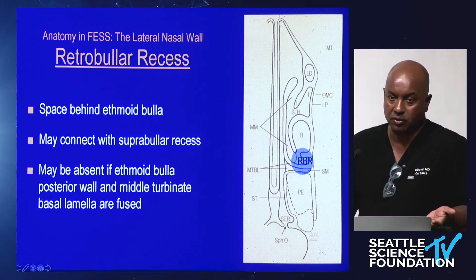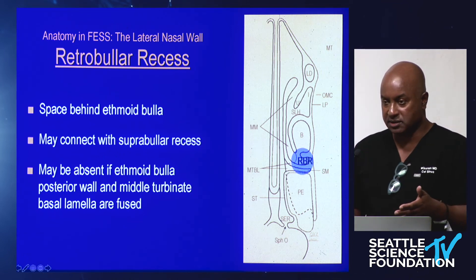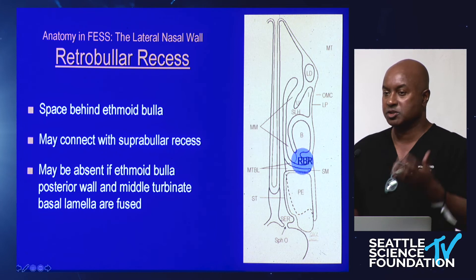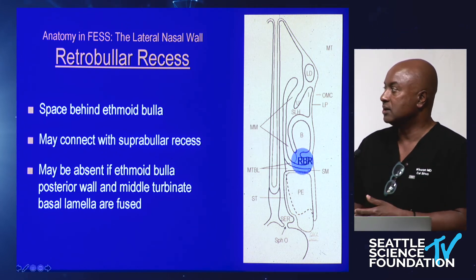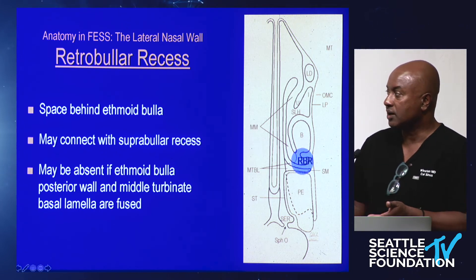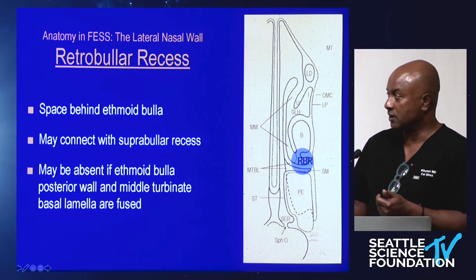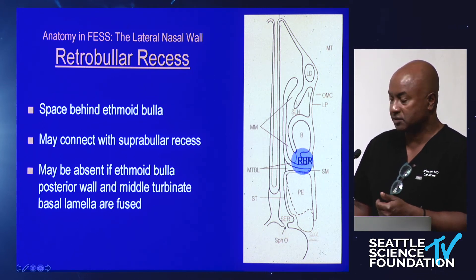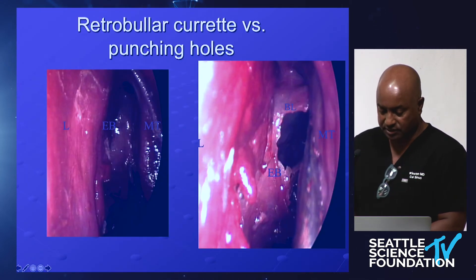The basal lamella of the middle turbinate inserts on the medial orbital wall. If you're unsure where the medial orbital wall is, back up: find the uncinate region, find the middle turbinate, find the medial orbital wall, go across with the scope, and there it is. Now you can use it as an anatomical landmark to dissect posteriorly through the posterior ethmoids.